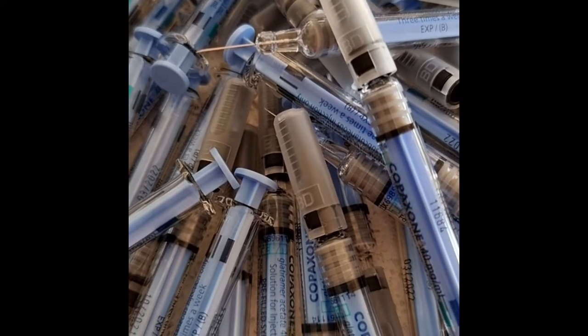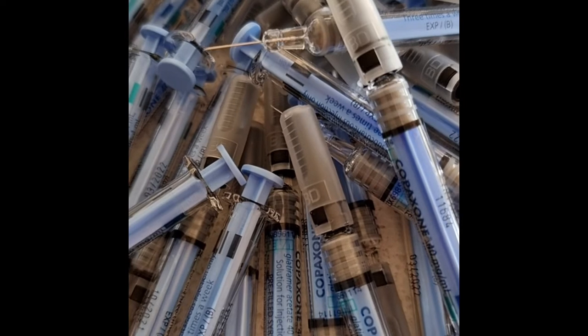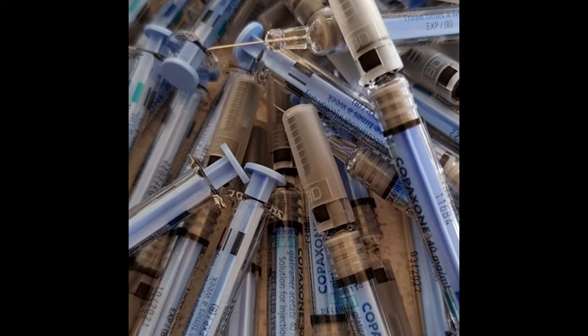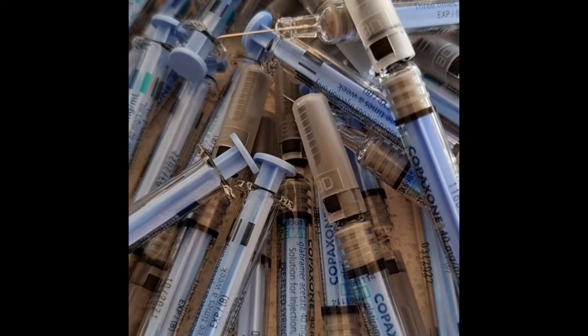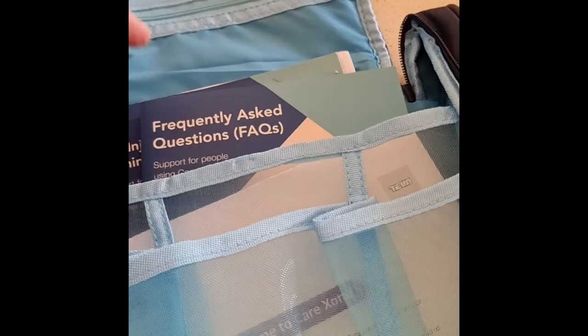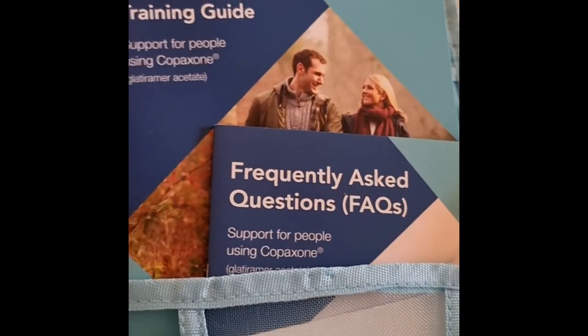I've been on Copaxone for two years now, it is time for a change. Let me just show you what you receive when you're prescribed Copaxone and how the program works. You will receive this great little pack, and inside it comes with a frequently asked questions booklet, a welcome note, and a training guide.